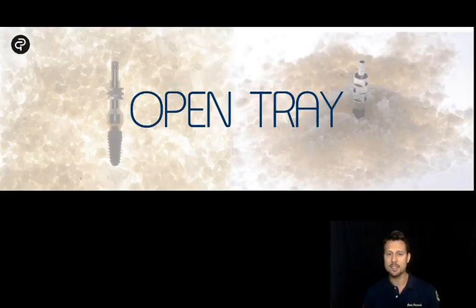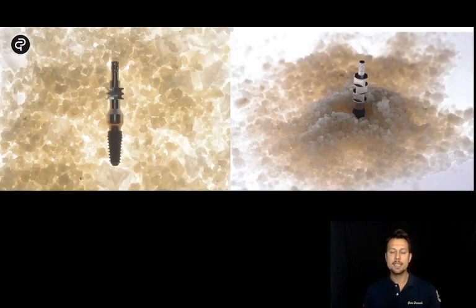Now, as we said, we have different kinds of impression technique. If we talk about analogic impression, so the old style, we have 2 different ways to act. The first one is the open tray. The open tray means that we use 2 kinds of transfer, one for the multi-unit abutment and one for the regular implants.